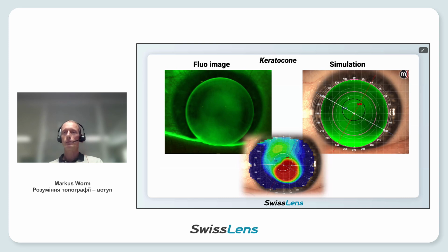And here for a keratocone, slightly bearing contact here and here. And you find the same in the simulation. And here in the middle, you can see a lot of fluorescein. Also here in the fluo image simulation, it shows really the same. So in summary, with such a high quality topography covering the whole cornea, in the simulation tool, you will get a much higher rate of success with the first lens.